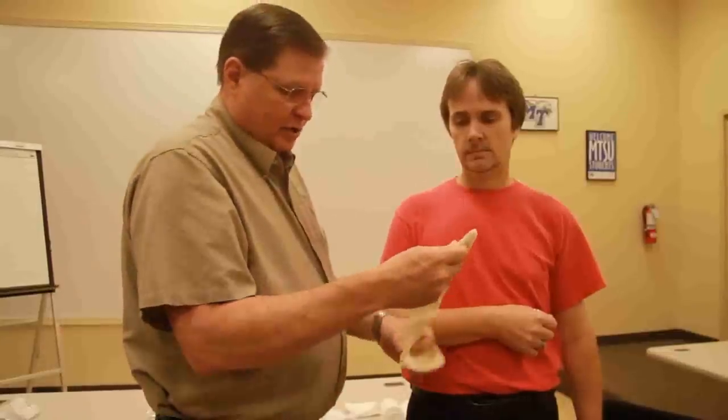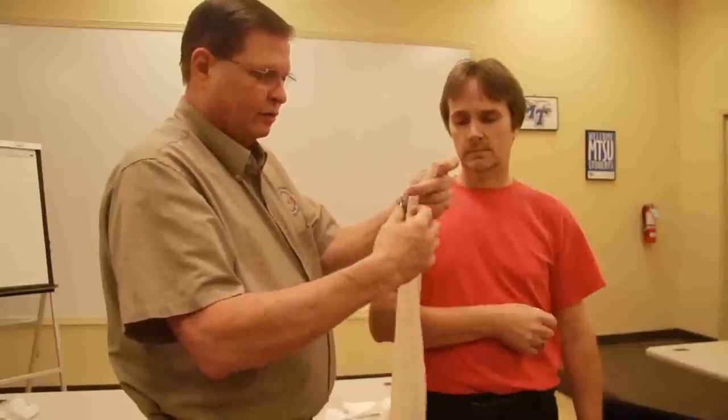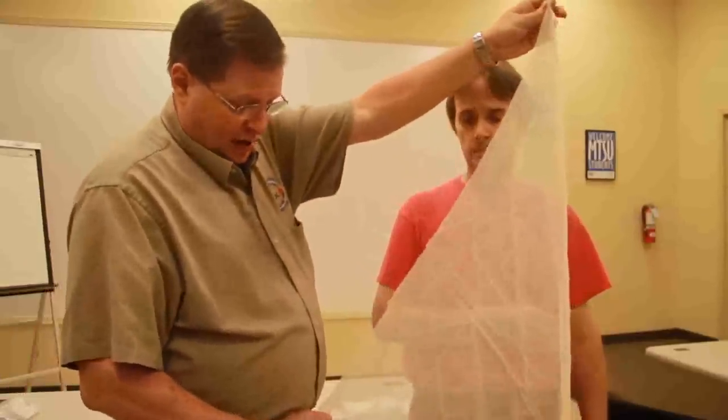The next thing we're going to do is we're going to open up our triangular bandage. You can tell it's already folded into a cravat. Once the triangular bandage is open, you can see it's a triangle.